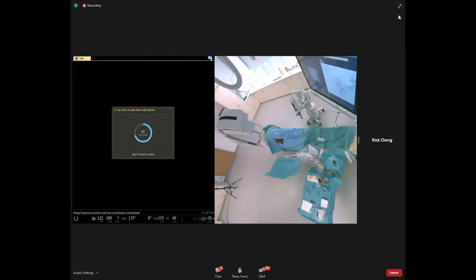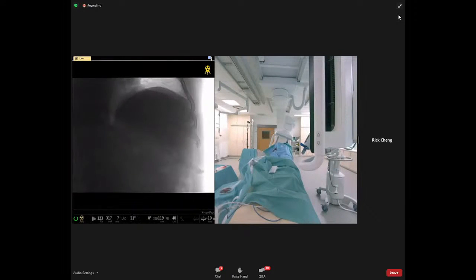After the arterial cone beam CT scan is performed, the patient can be asked to breathe superficially just before the next cone beam CT scan. Hold the acquisition switch until both cone beam CT scans are acquired. Meanwhile, the interval time is displayed on the monitor.